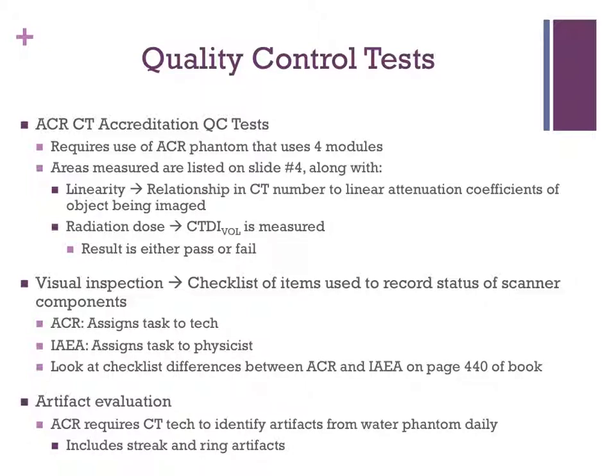Linearity refers to the relationship in CT number to the linear attenuation coefficients of the object being imaged. Remember, we discussed this a little bit in chapter 9. For radiation dose, the CTDI volume is measured, and it should be either a pass or fail result depending on the protocols being measured.